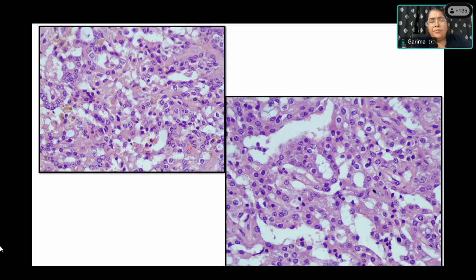Okay, so what are the glandular features? The pattern shows monomorphic nuclear structures, which means it is monomorphic, and the glandular structures are acini. Big glandular structures are there, plus a lot of cystic spaces and papillary structures. And these cells which you are seeing, what kind of cells can you see in an acinic cell carcinoma?